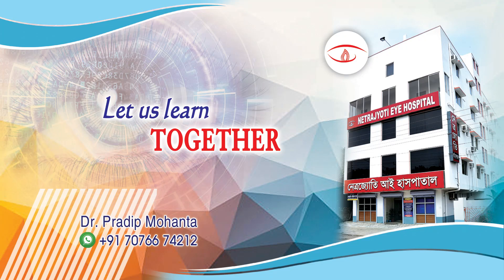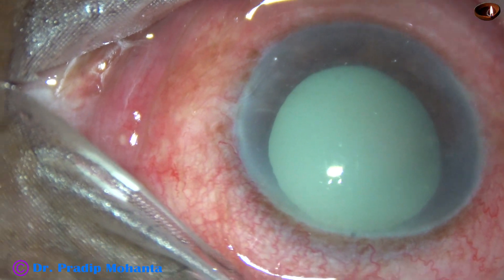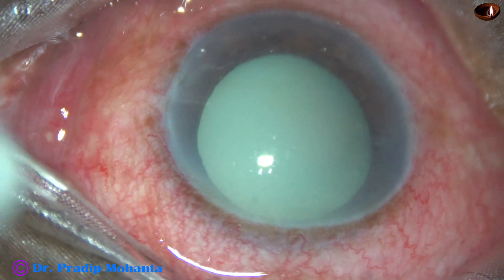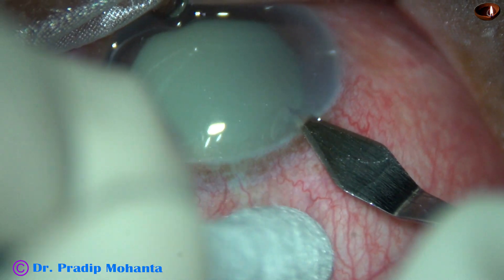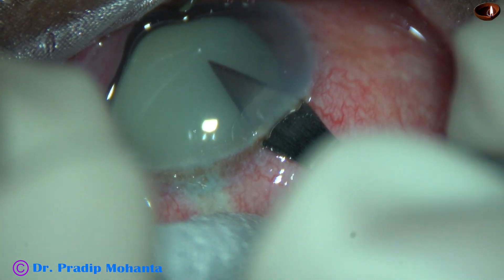Friends, welcome. Let us learn how to manage a hypermature Morgagnian cataract. An old lady of 72 has come with this kind of cataract and high intraocular pressure. With medication, the pressure has come down to 26 mm of mercury and I have taken up this case for surgery.